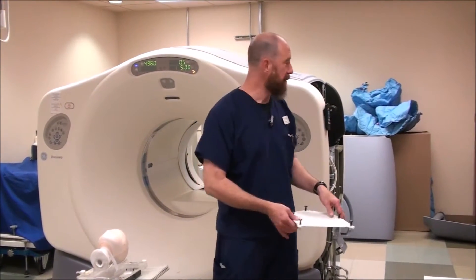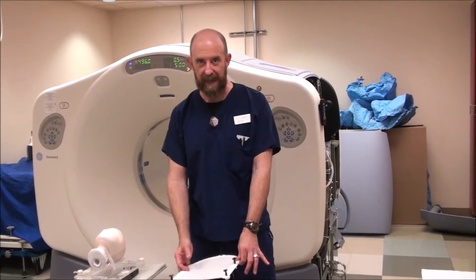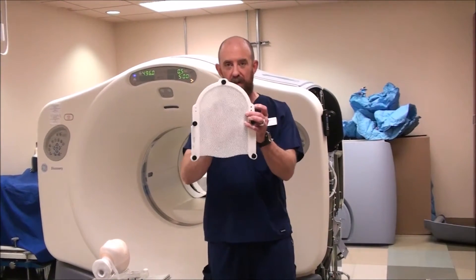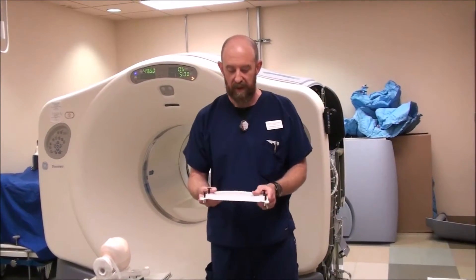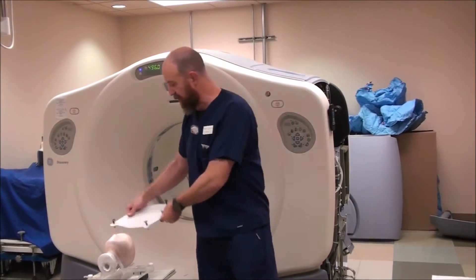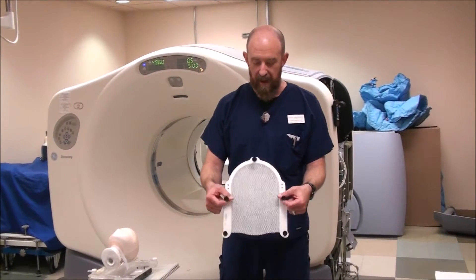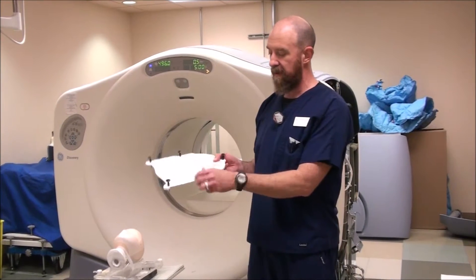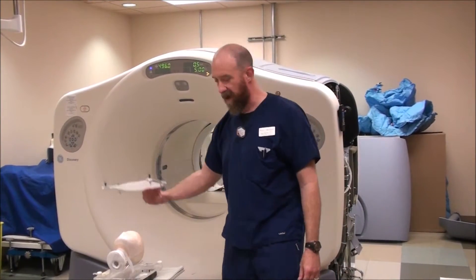When you pull the mask out of the water, I usually just throw it down on a towel on the floor. Knock some of the water out of the mask because in the holes, a lot of that hot water is going to be trapped, kind of like a honeycomb. You don't want to come over with scalding water and throw it right on a patient, so knock some of the water out. You can see that on this particular type of mask, there are buttons that go in — that's the part that goes down onto the patient.